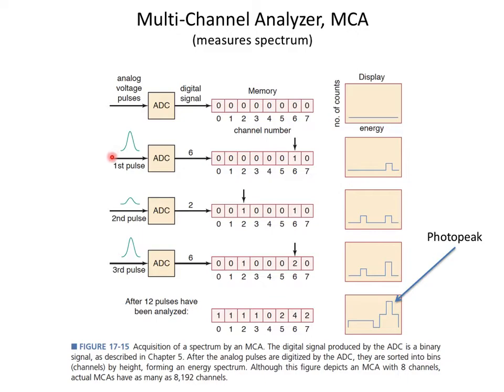This ADC unit will make a pulse height analysis to say, what is my threshold here. And we haven't talked about where these come from, but you're going to have a bunch of PMTs sitting on top of your detector.